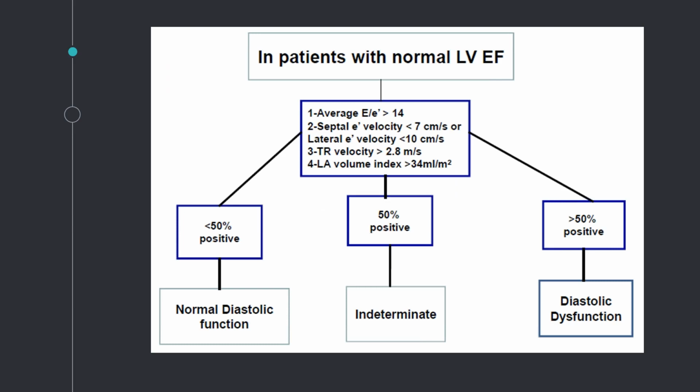Yeah, so when we did that paper in the SAPIEN registry, we spoke to JO about this exact thing, because people were arguing why there was no normal diastolic function in our cohort of disease patients. And he said, well, that's obviously a flaw of this diagram. He seems to say that if you have a regular normal EF study with no other significant disease, and you have those findings, then it's indeterminate. But if there's some sort of pathology on the echo, then you use the other algorithm. And if it's indeterminate, then it may not be resolved. So there are a lot of indeterminate.